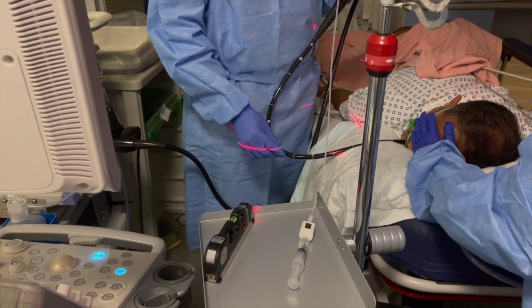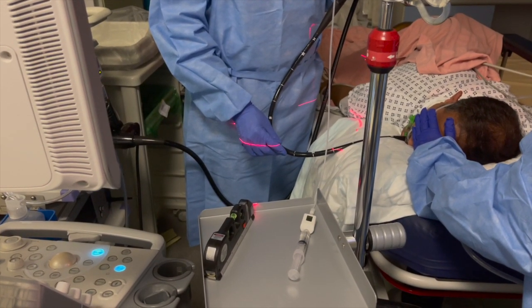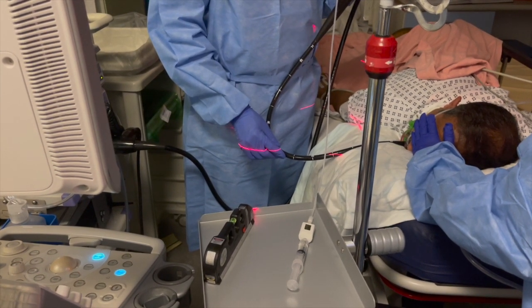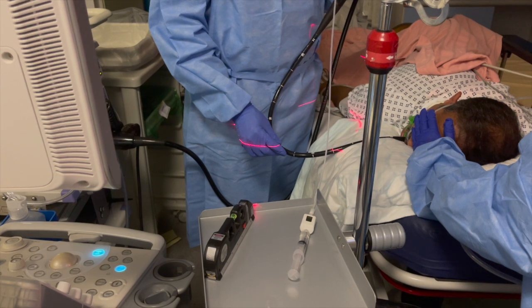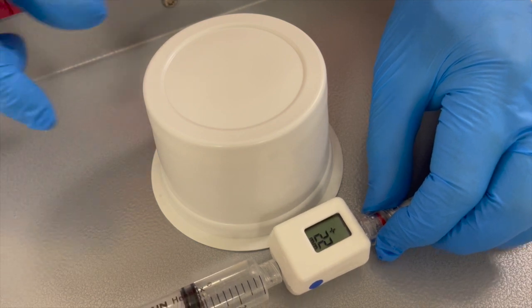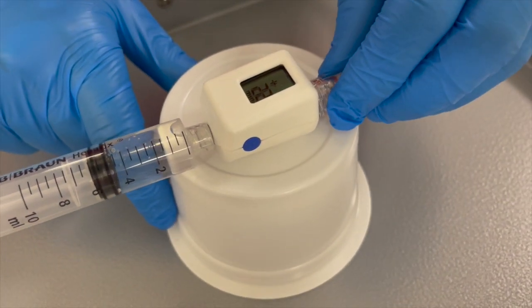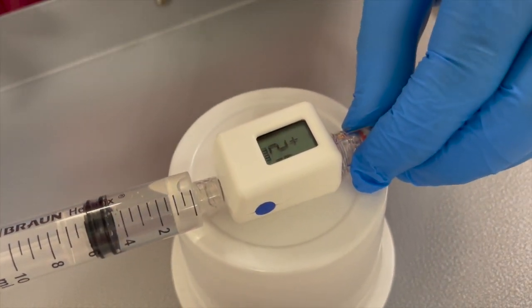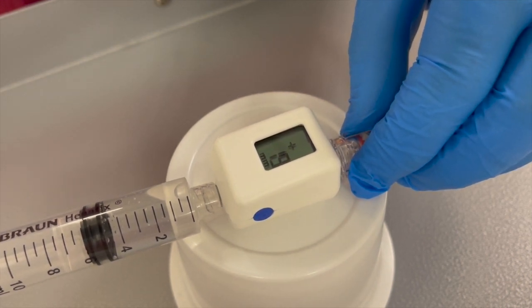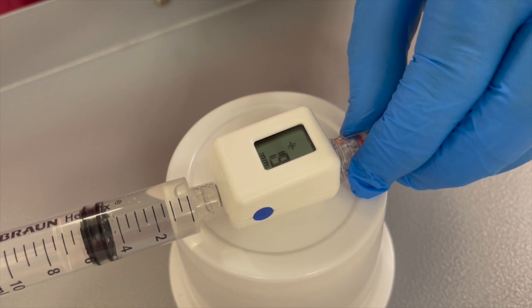It should be noted that the absolute values for each measurement are less vital, but of course it is very vital to have consistency when doing both sets of readings. It is vital to keep the manometer in a similar place. You can see here by changing the position by a few centimeters, the manometer reading changes from 22 to ultimately 18.